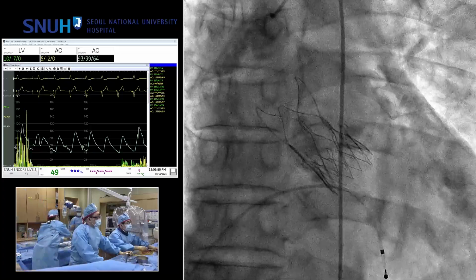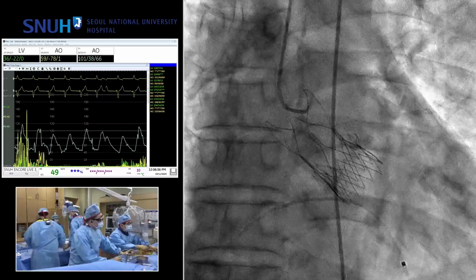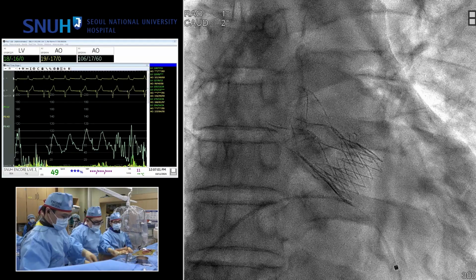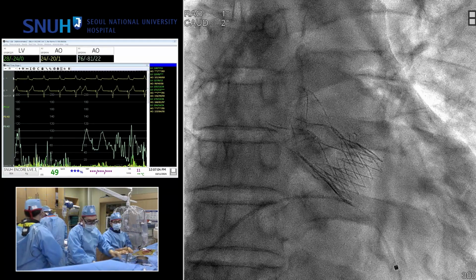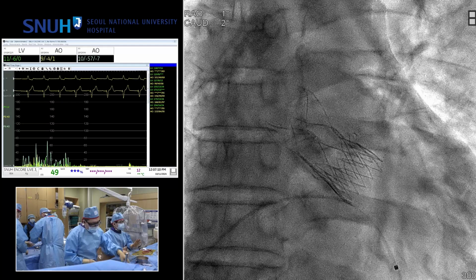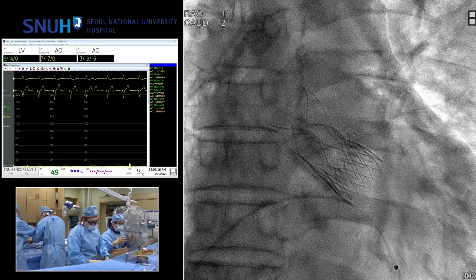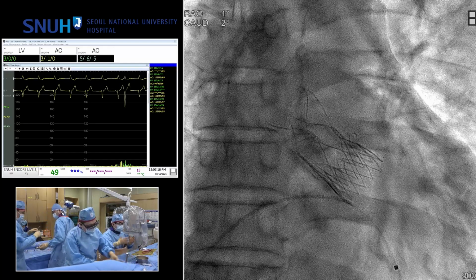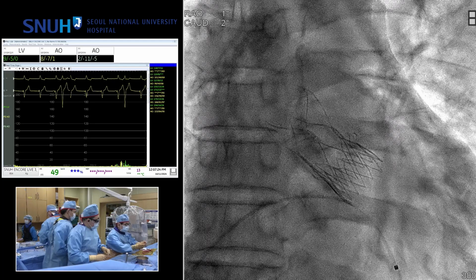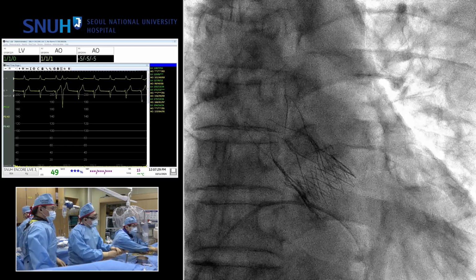If you take too long for the cannulation after this valve, that is the disadvantage of this valve. So quickly, very fluently, is the advantage for this valve. Not advertisement. This is a live demonstration course. If I do well or not well, it is educational, good information for the audience. Because as shown, we compare 3.5 Judkins left or 4 in this case.